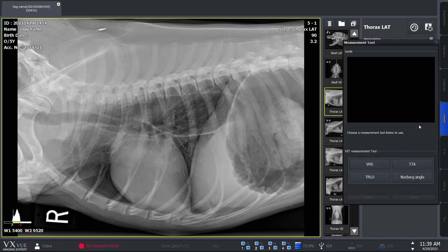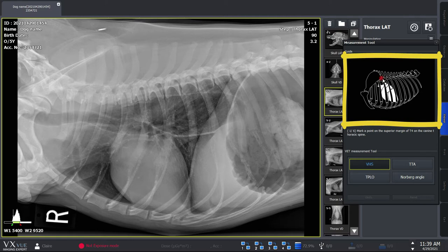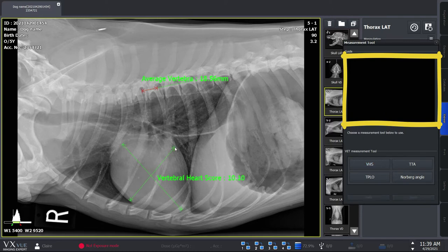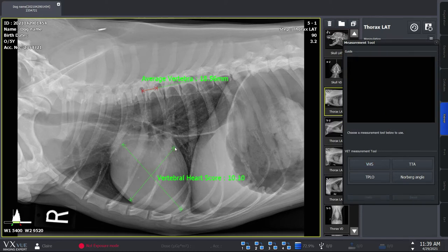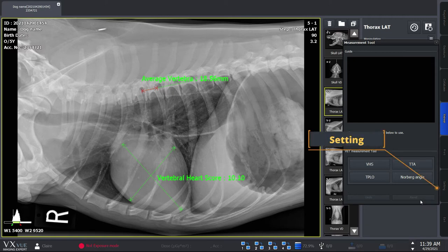VXVue supports useful measurement tools for Vet applications. Let's take a closer look at how to calculate VHS. You'll see the points and guidelines in the guide area. Follow the guidelines and you've calculated the VHS. You can choose to change or delete the measurement annotation after completing the process. We also have the undo and reset button here for easier corrections. You can change the font size and color from the setting mode.